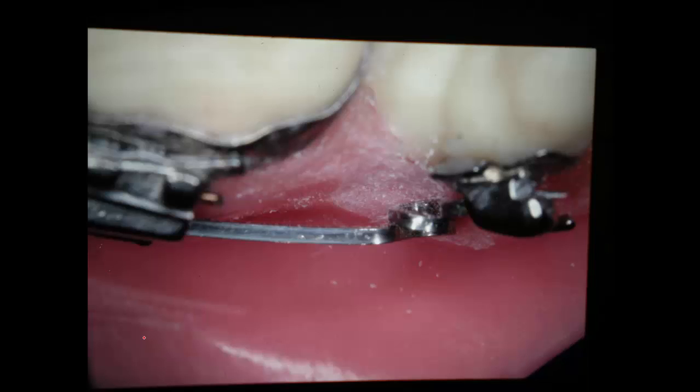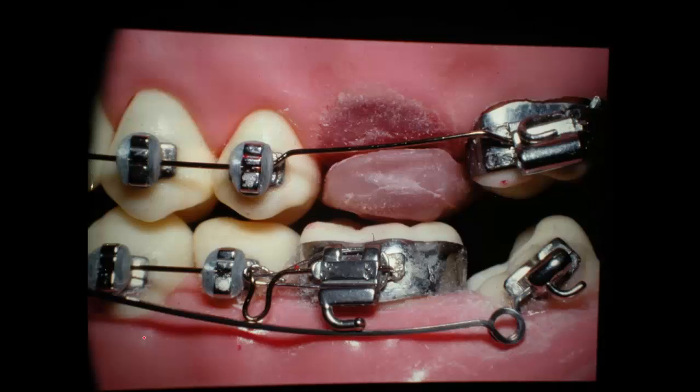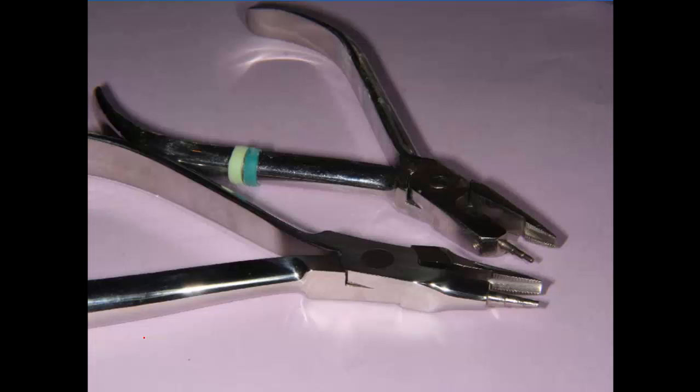Now, looking down on it from the top, it's the same thing. Another view of looking down, and this one's got a rather long arm out here to raise it up and hook it. Again, the same thing with the loop going up.